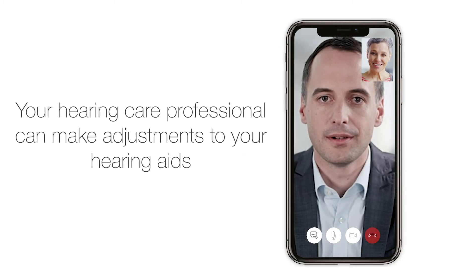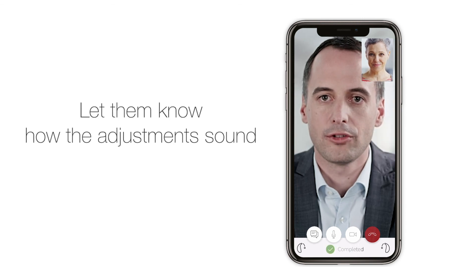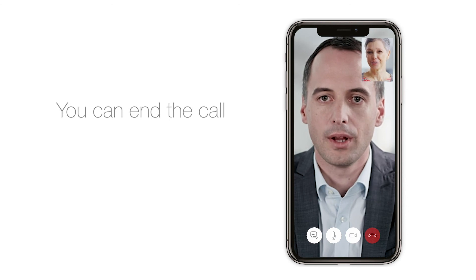Your hearing care professional can make adjustments to your hearing aids from the clinic. Have a conversation with your hearing care professional during the call and let them know how the adjustments sound. Your hearing aids are now updated, and you and your hearing care professional can end the call.